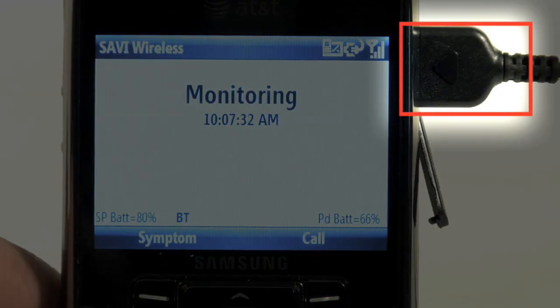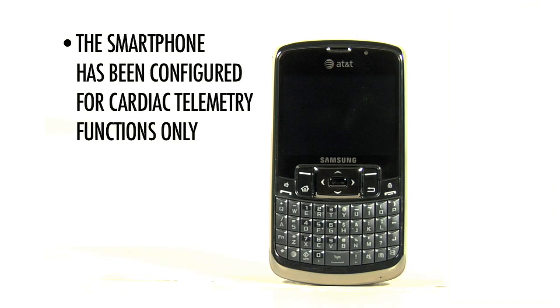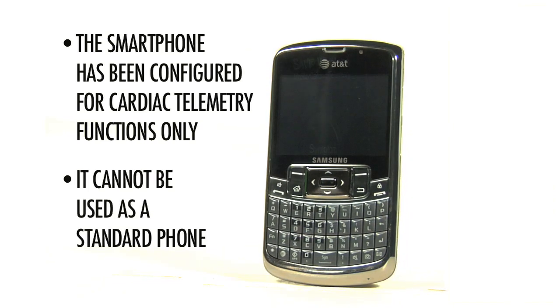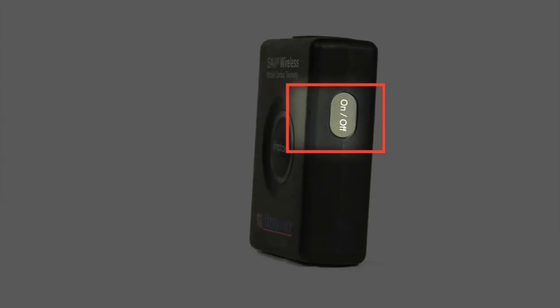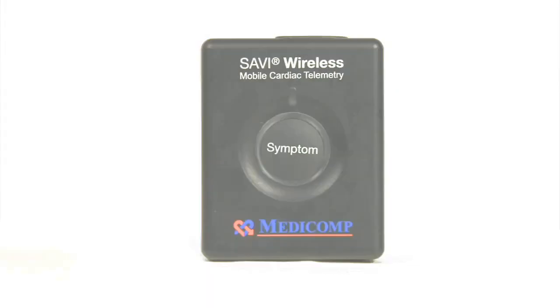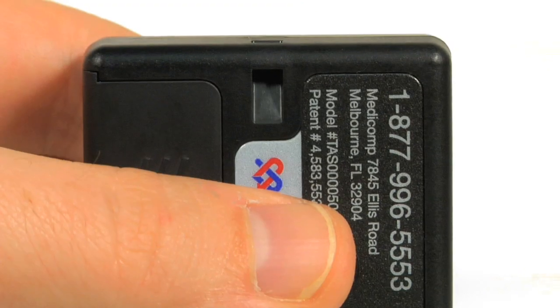There is also a charging port. The smartphone has been configured for cardiac telemetry functions only and cannot be used as a standard phone. Now let's become familiar with the pendant. The pendant has an on-off button, symptom button, patient cable, patient cable connector, and lanyard hook.